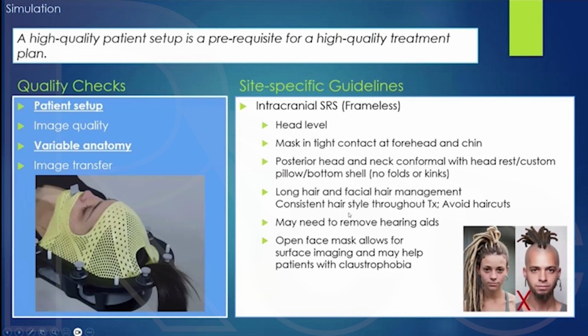If the patient has long hair or facial hair, then that needs to be managed. And so by managed, I mean that the long hair could be pulled out of the hole in the mask so that it is not making contact with the mask. And further, the patient needs to be advised to avoid haircuts during treatment.